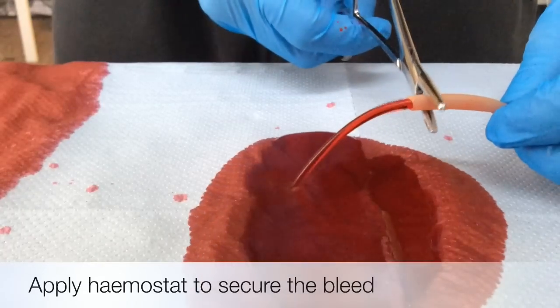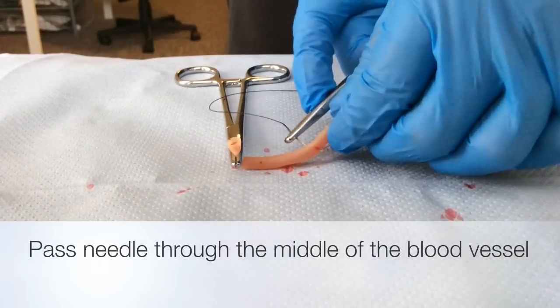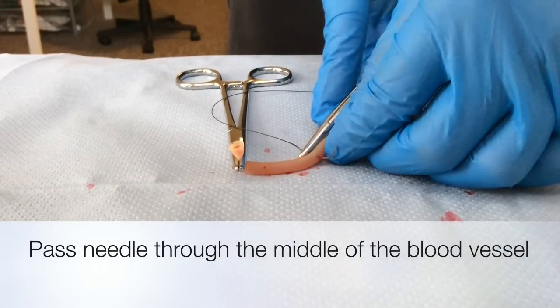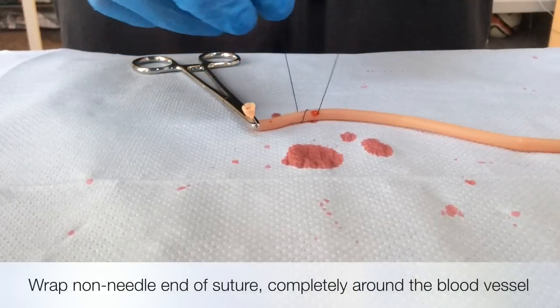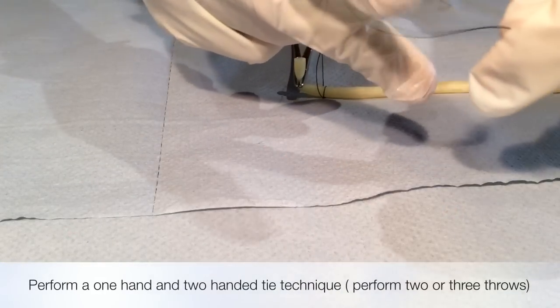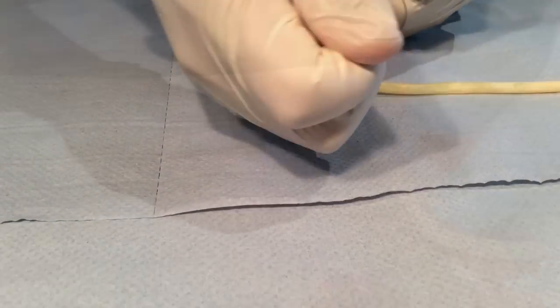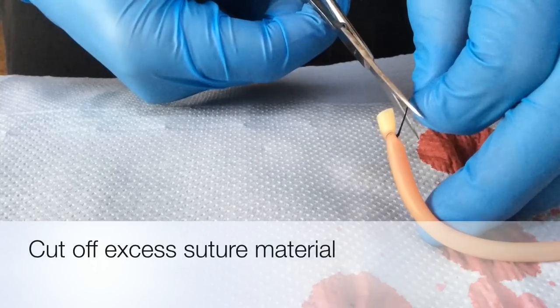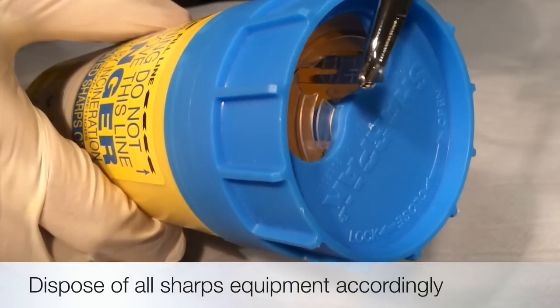To summarize: apply a hemostat to control the bleed. Pass a needle through the middle of the blood vessel. Then perform a one or two handed tie technique. Cut off excess suture material. Dispose of sharps equipment accordingly.